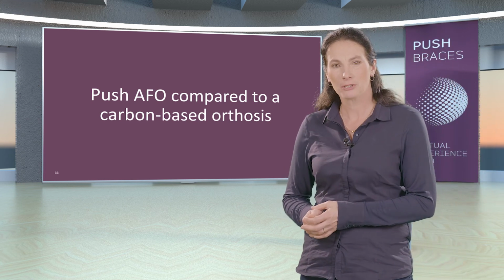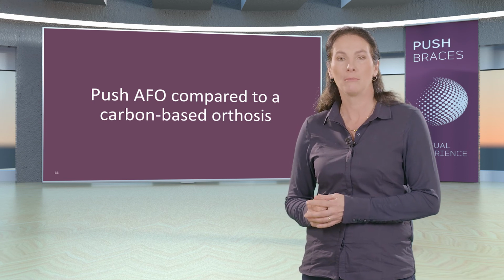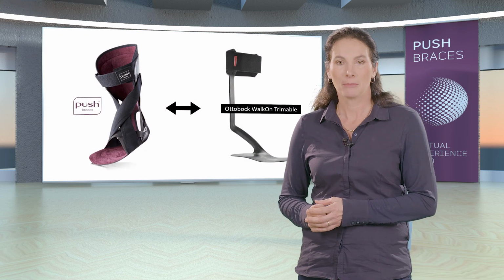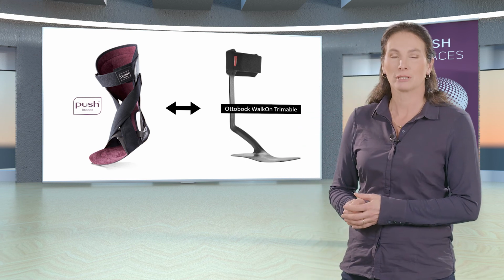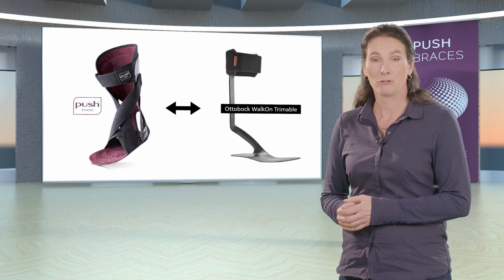In our second research question, we want to know how Push AFO performs compared to a carbon-based orthosis. We researched this by having the subject carry out the same task with the Otto Bock WalkOn trimmable, a renowned product that caters to the same target group as Push AFO. The subject has user experience with both products.